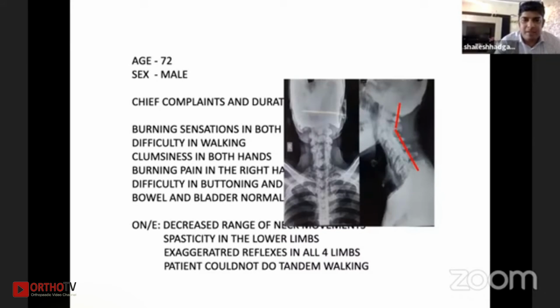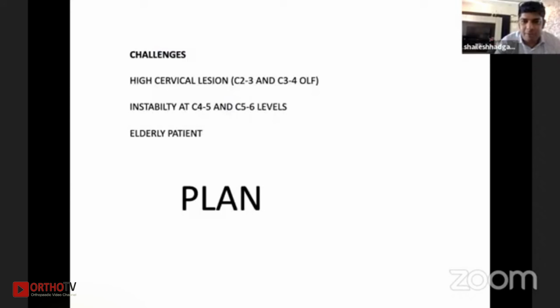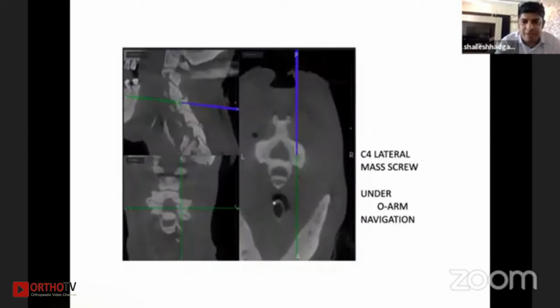And these are certain interesting cases where we started doing cervical pedicle screws in a high angular cervical deformity with myelopathy. If you see the significant deformation with myelopathy, we could put cervical pedicle screws in the cervical spine. And really life becomes very comfortable, because you are seeing the vertebral artery, you are seeing the cord, and life becomes really easy.